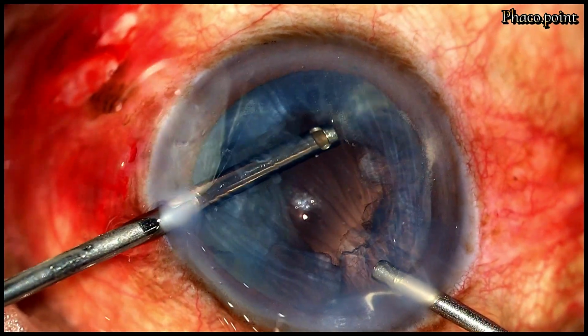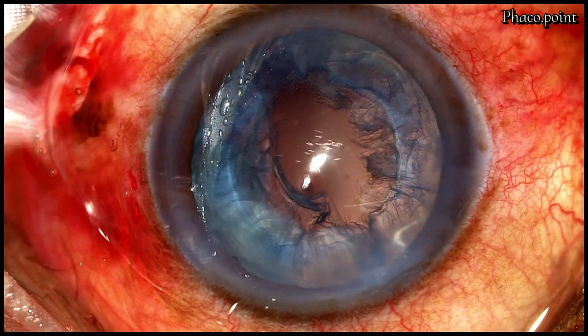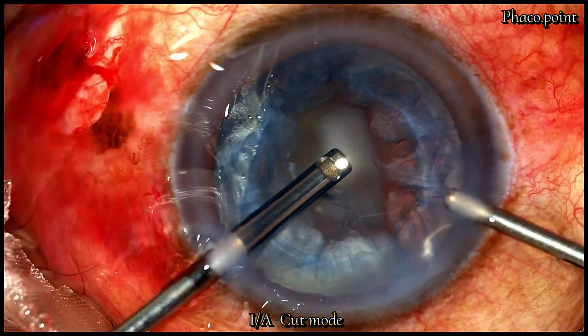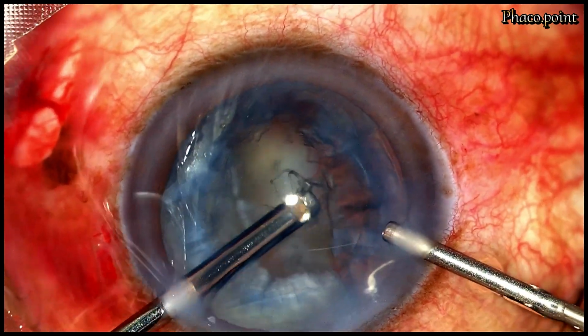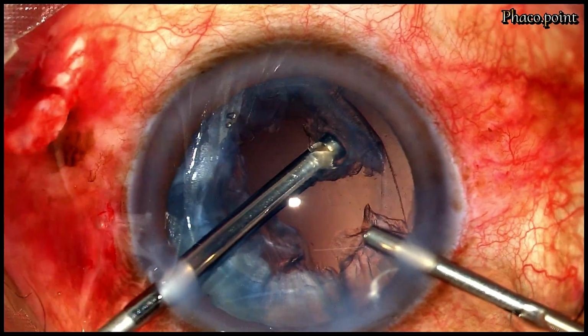It's important to always remember that there should be no attempt at moving the vitrectomy cutter posterior to the area of the rent, and certainly not going to try and fish out the fragment that has fallen behind. Having completed the limited anterior vitrectomy, we now go in the IA cut mode with a view of removing the cortex. You will note how the irrigation probe maintains the anterior chamber and stabilizes the globe, whilst the vitrectomy cutter now works like an aspiration cannula, drawing out the cortex from under the rhexis and then aspirating it.